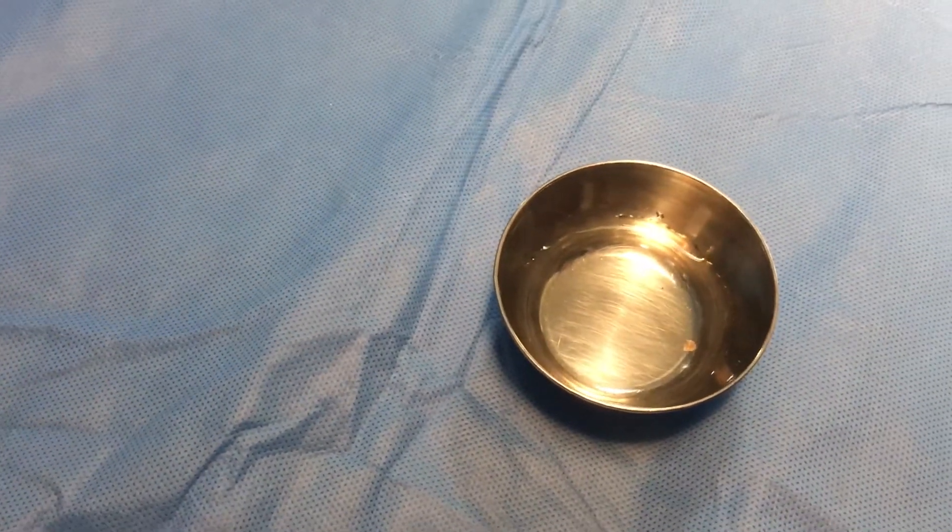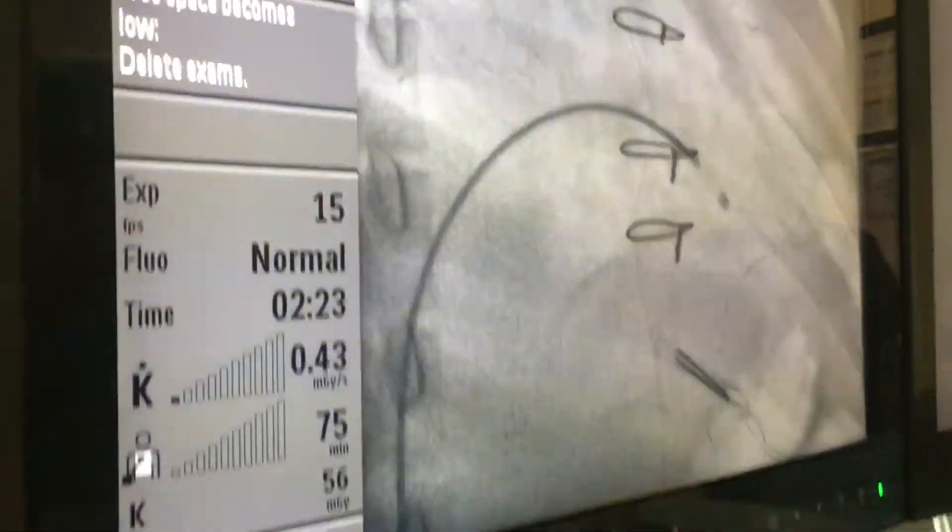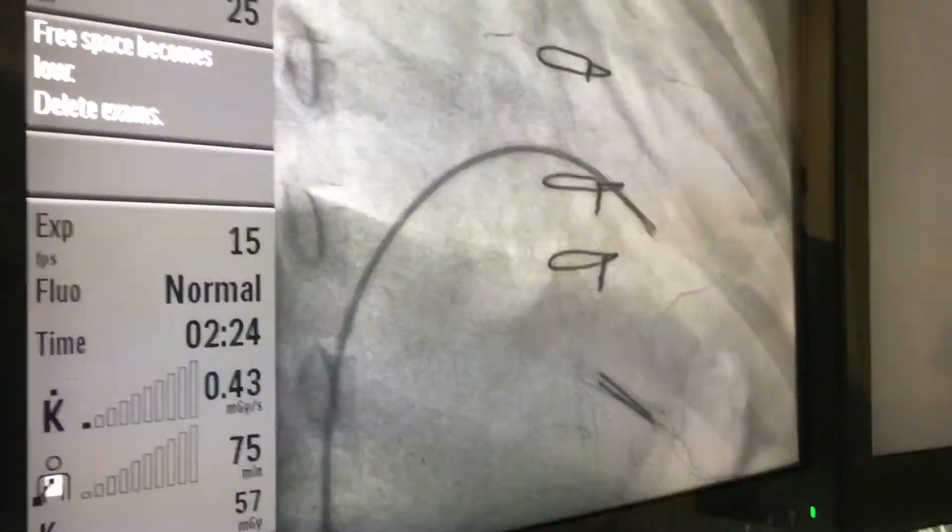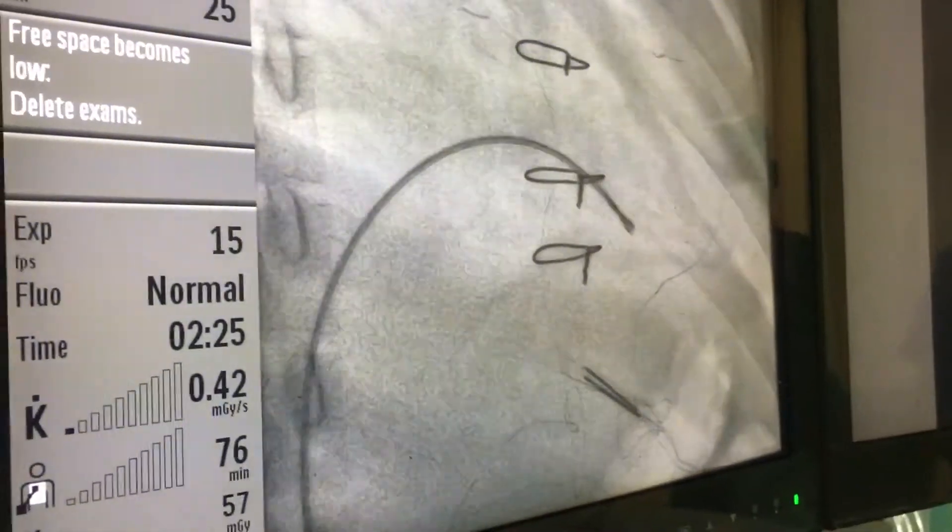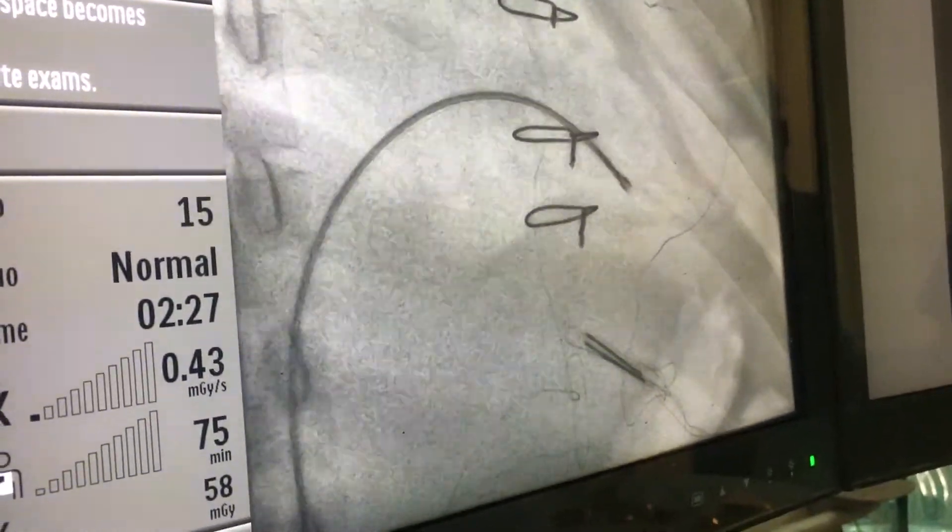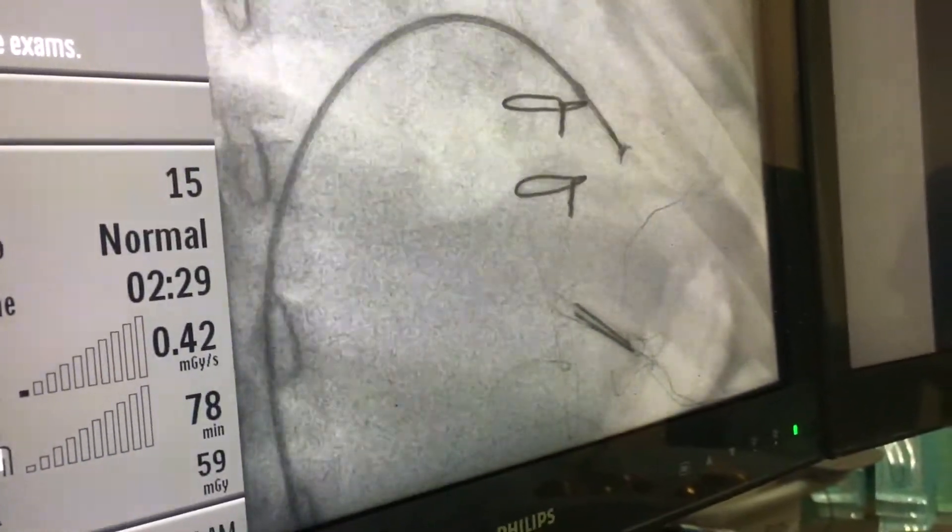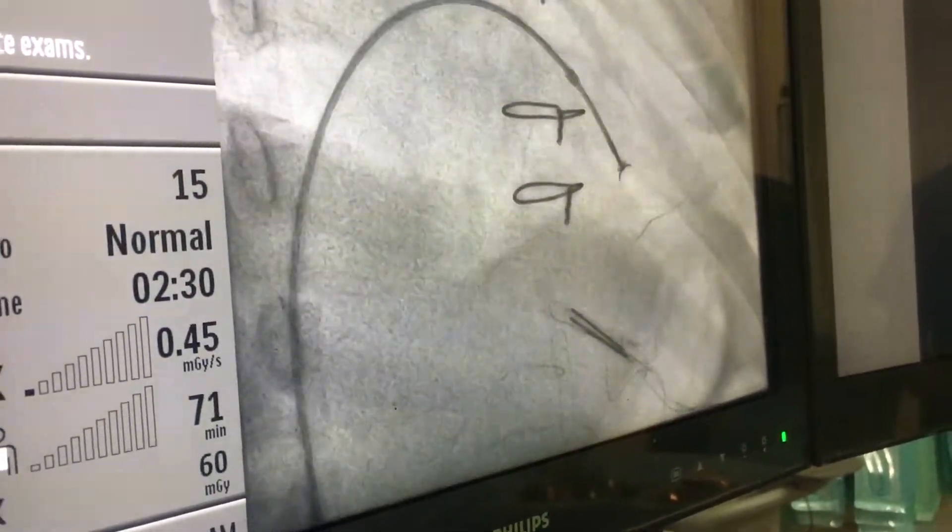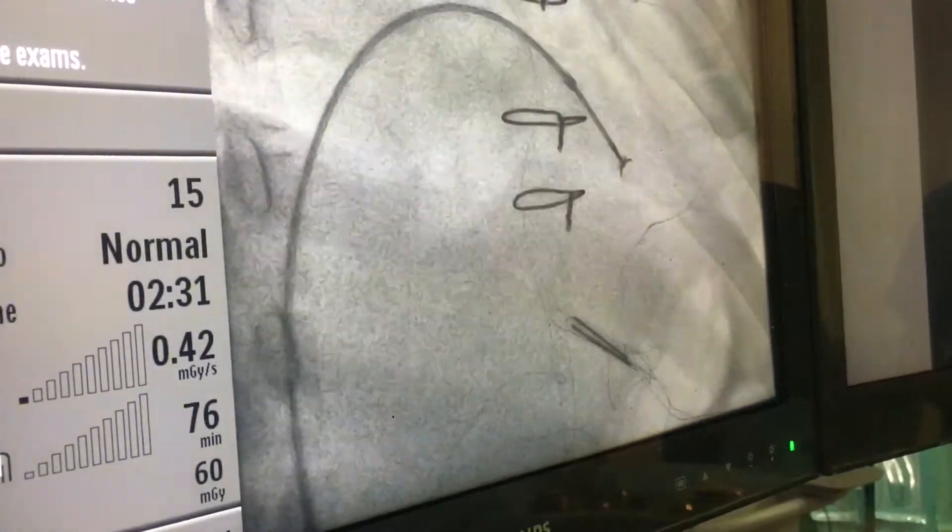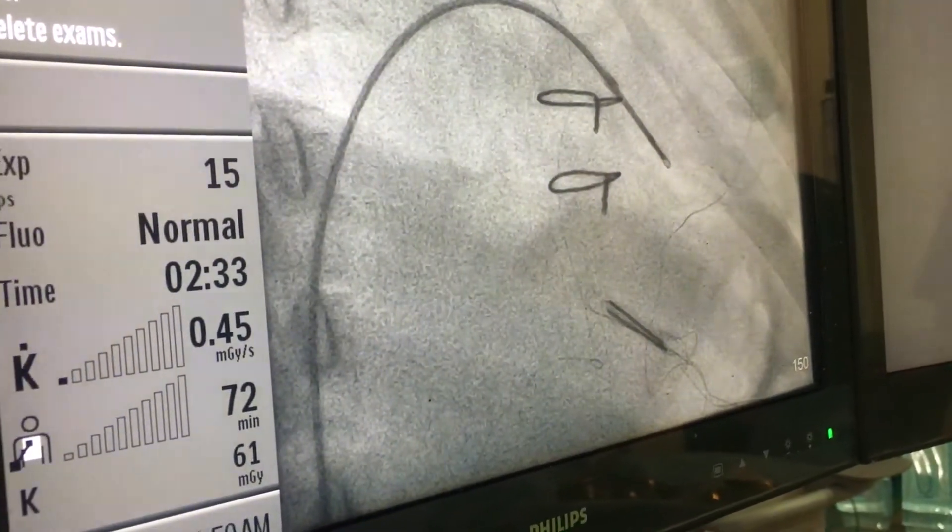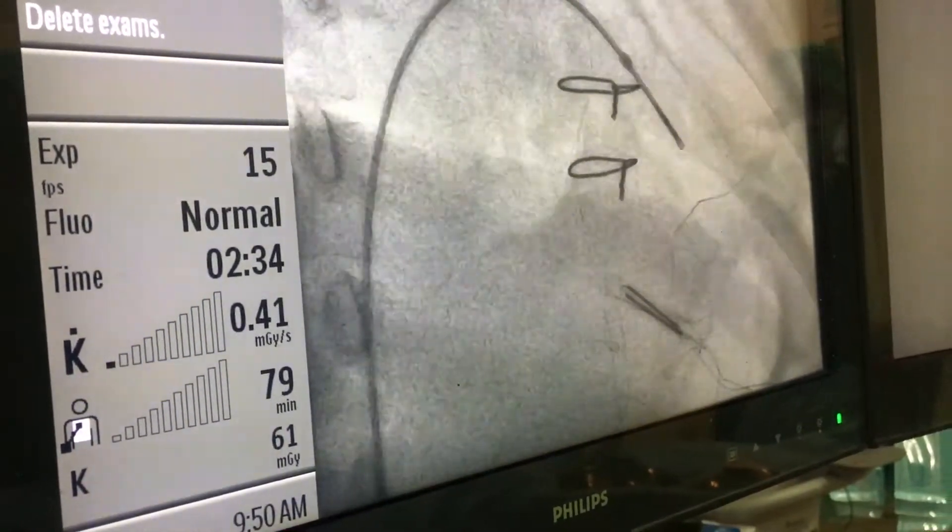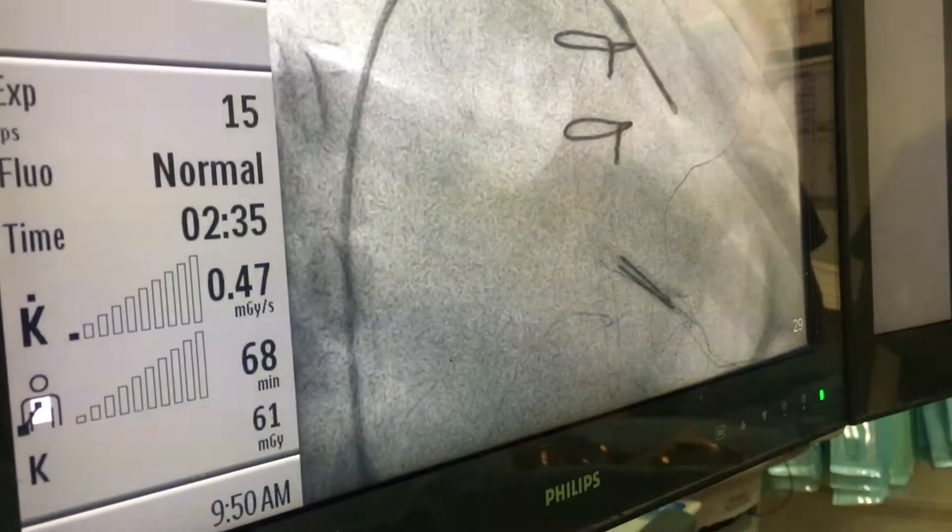We'll go for one more tissue. Show that. So in order to avoid the perforation complication, which can rarely happen, so whenever we enter outside the Mullein sheath, we enter with the forceps open. So that's all. It will not go and then pierce it. It's not like we go there and then open. Okay, so I have taken this. We'll just go to LAO and then confirm once.